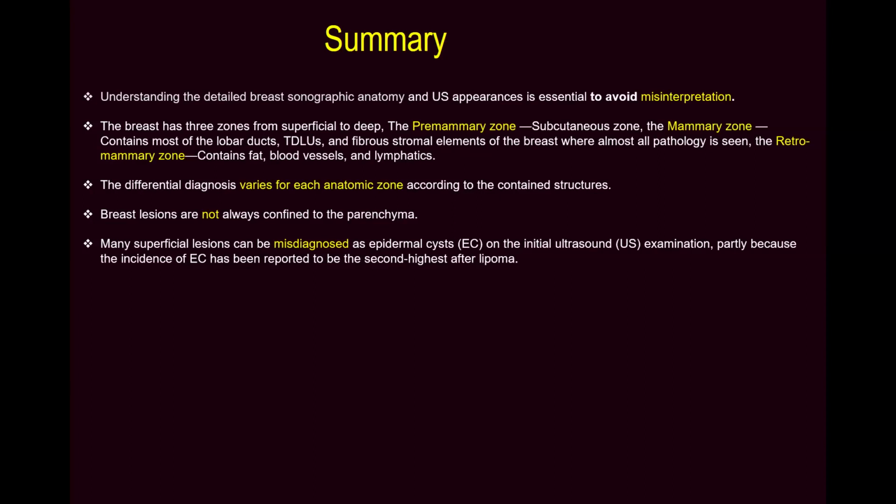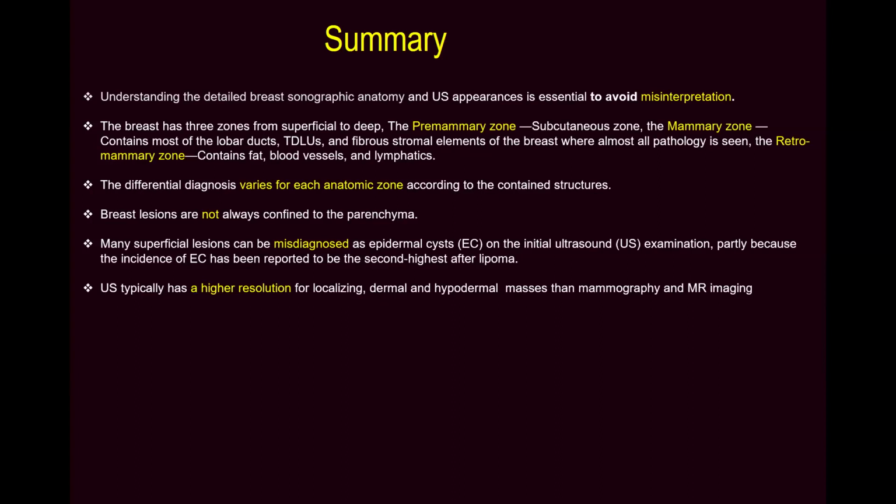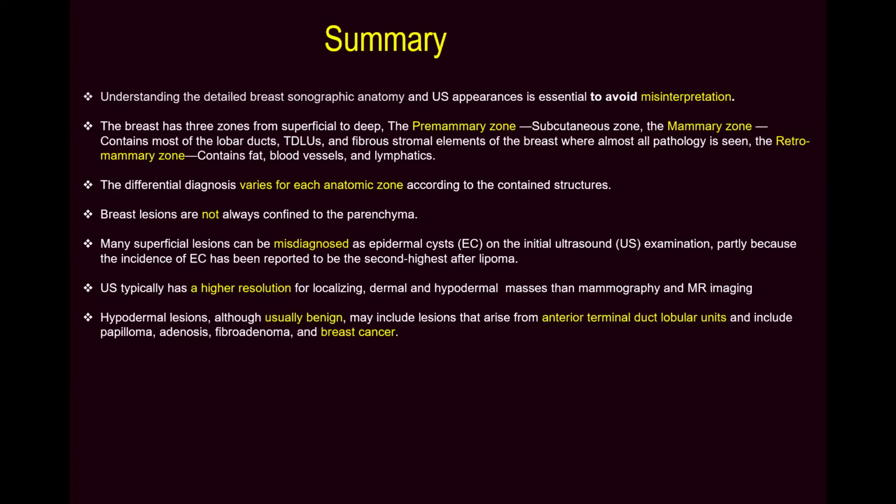Because of the high incidence, as we mentioned, second highest after lipoma. Ultrasound typically has higher resolution for localizing dermal and hypodermal masses, and it is superior to mammography and MRI in detecting these lesions.